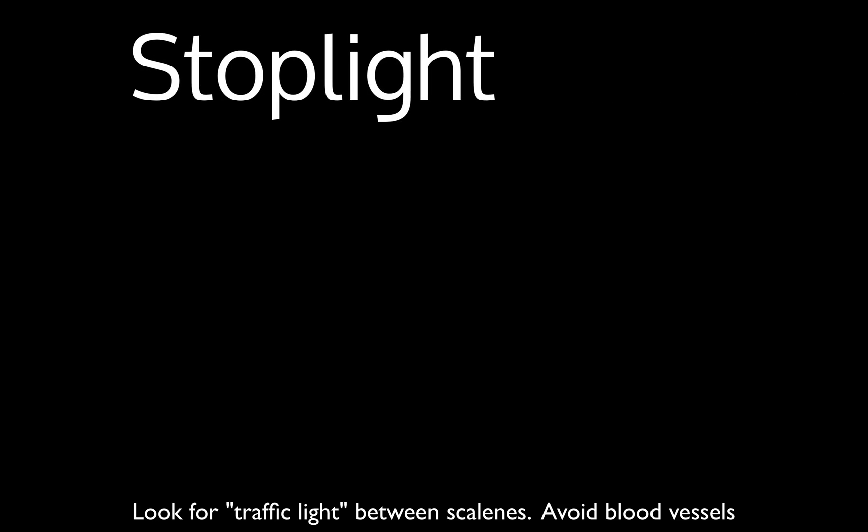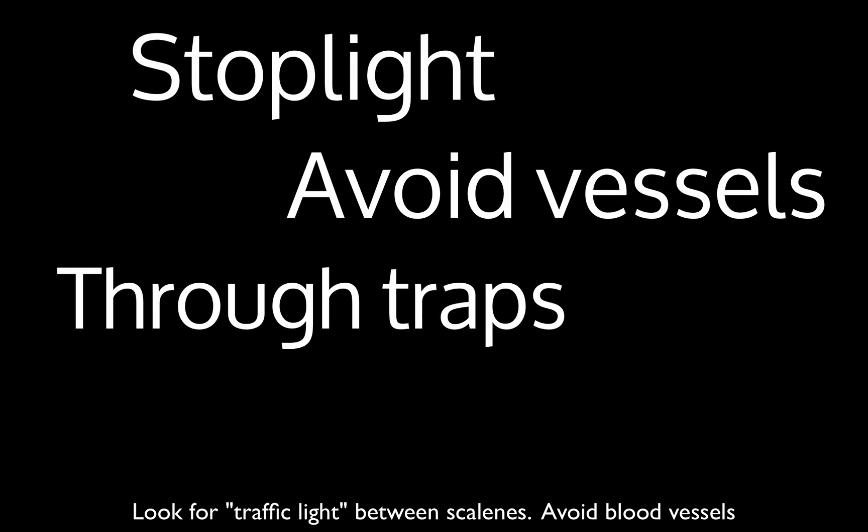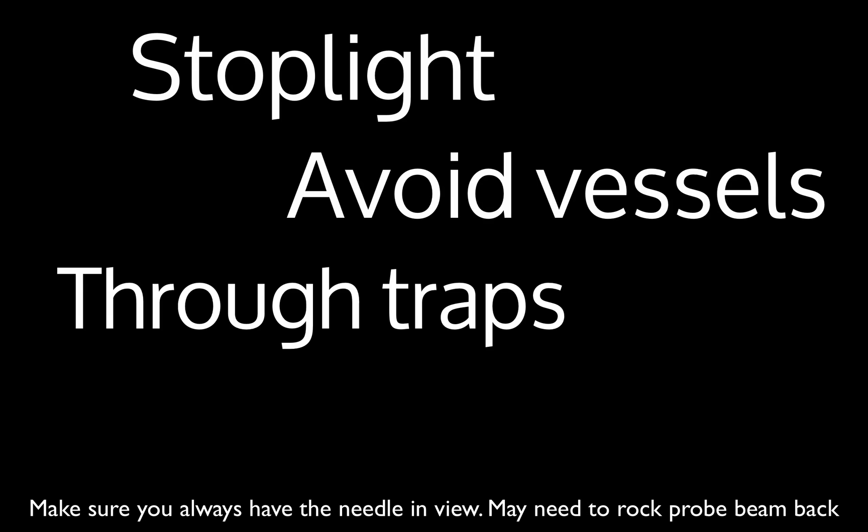To recap: look for that stoplight sign between the anterior and middle scalene muscles. Avoid the blood vessels — throw on color flow along your path to make sure you're not lacerating arteries or veins. The needle actually goes through the traps, with the transducer anterior to the traps and the needle coming in from behind, in-plane with the ultrasound beam. Rock the transducer towards the needle to find it and track it along until you reach the border between the middle scalene and the interscalene groove.